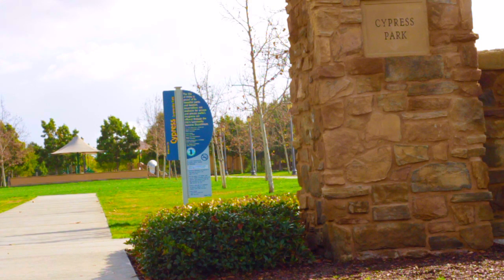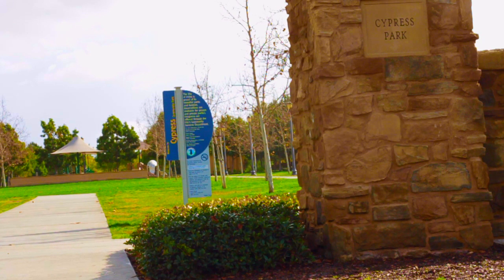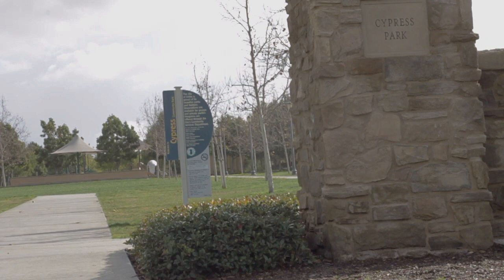On the sides of the video, you will see some icons that will provide more information. Let's first explain these icons. First is color and contrast. This shows how vibrant the colors are and how well the image pops in your vision. This can be thought of as the quality of your vision. Here's an example of good color and contrast. And here's an example of poor color and contrast, where the image looks very grayed out.